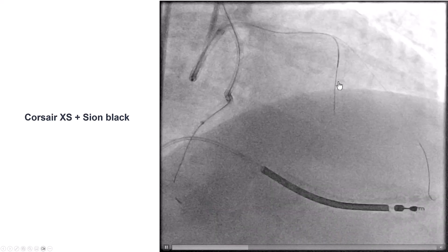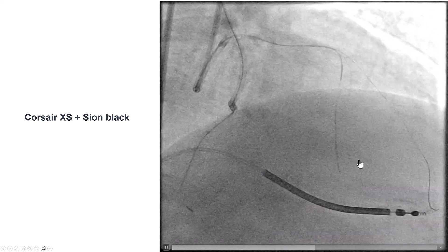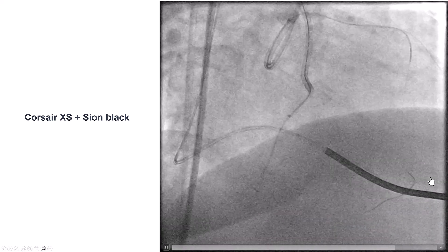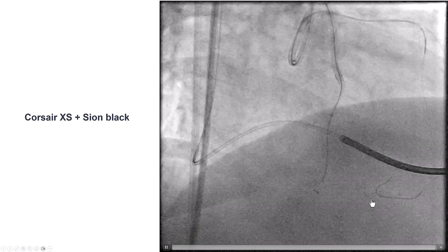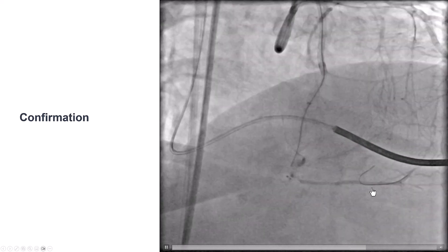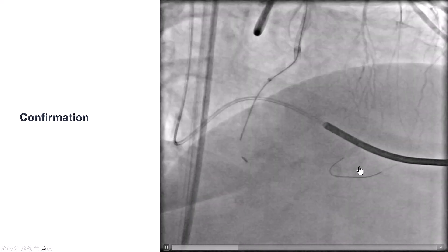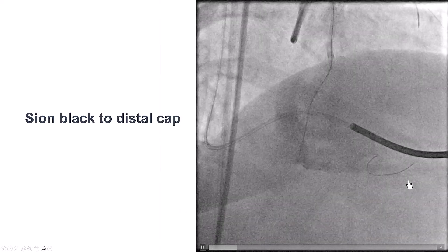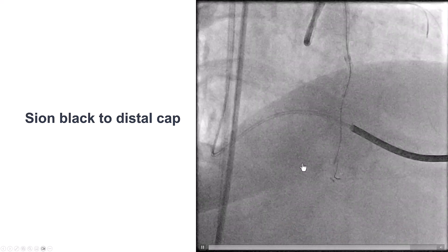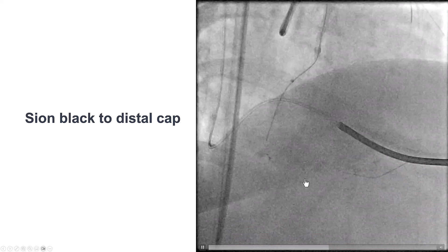The next step was to try to go retrograde, so we tried to surf through the septal collaterals. We used a Sion Black guidewire with various maneuvers — it takes a big bend and then seems to be advancing along the course of the posterior descending artery. We confirmed we were in the PDA by doing an injection from the left, and then advanced the Sion Black all the way into the distal right coronary artery, close to the distal cap of the CTO. The Stingray was still there in the extraplaque space.